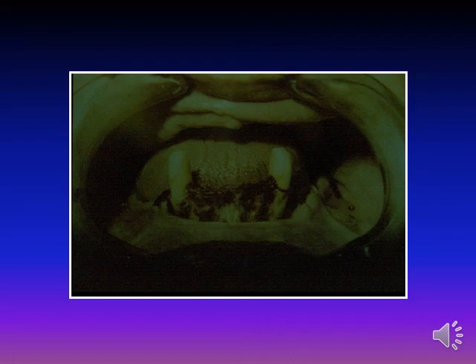Number three: endodontic treatment of the root, which is extracted and reduced, and then replanted and submerged. And here ankylosis may occur. Number four: pulpectomy is performed in the residual root, which is submerged without root canal therapy, without filling. And here also inflammation and necrosis may occur.